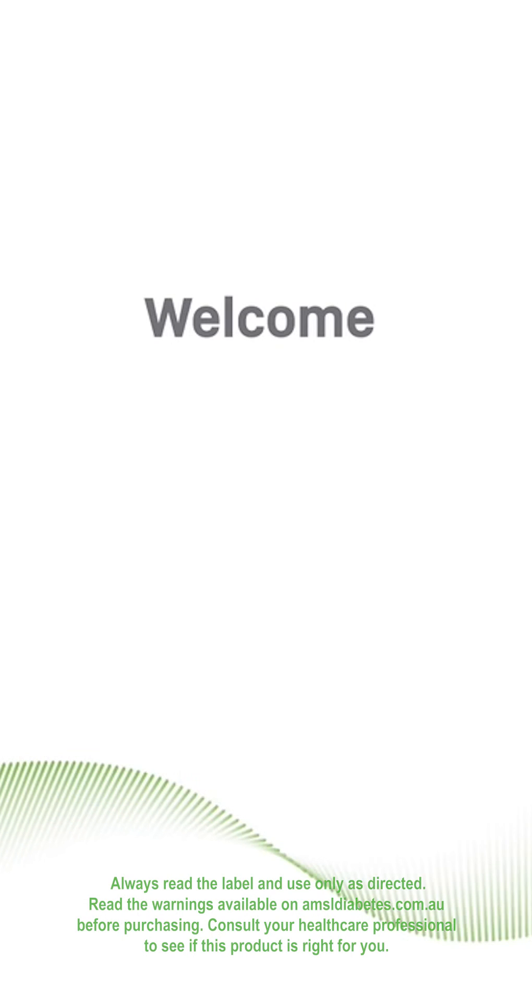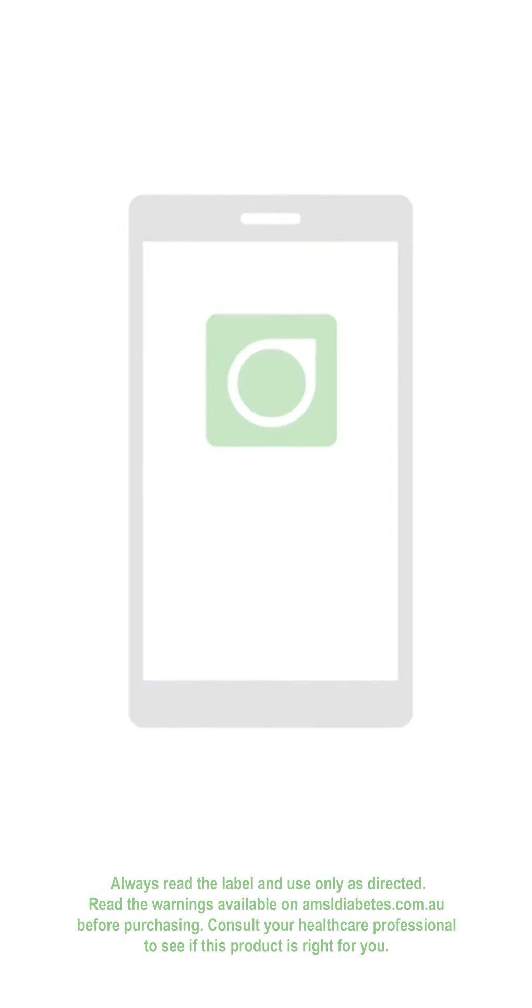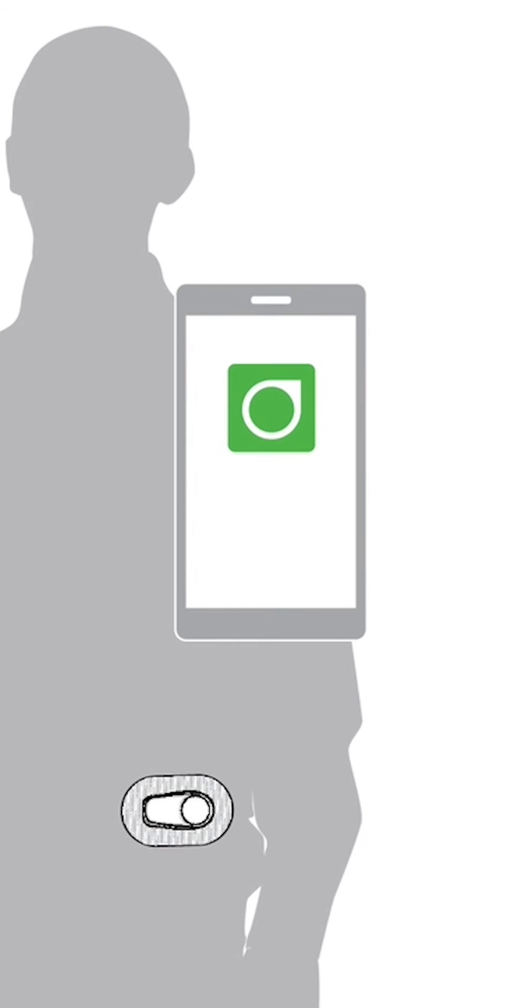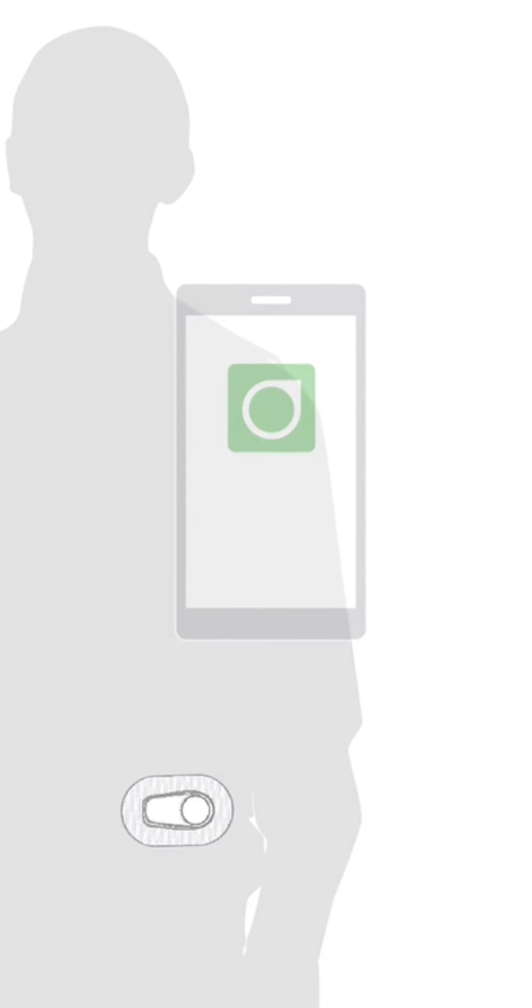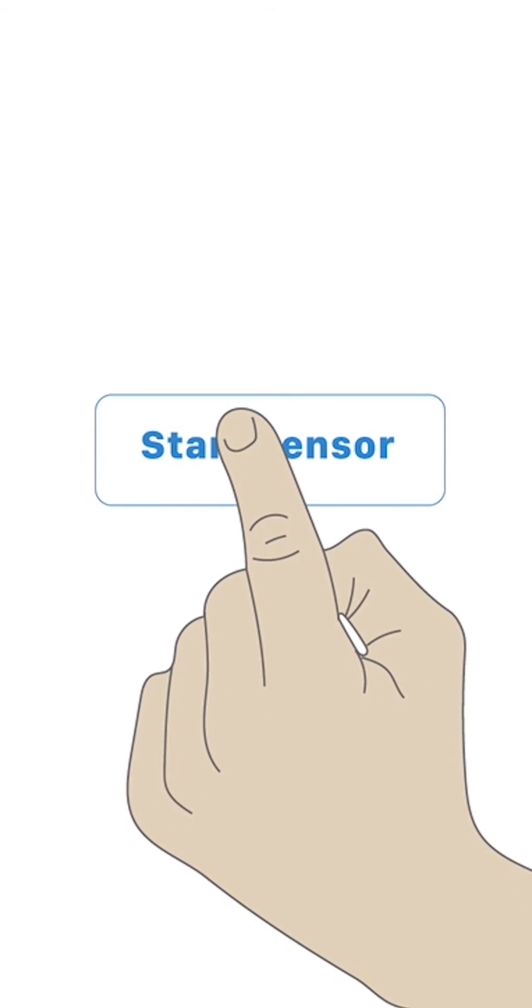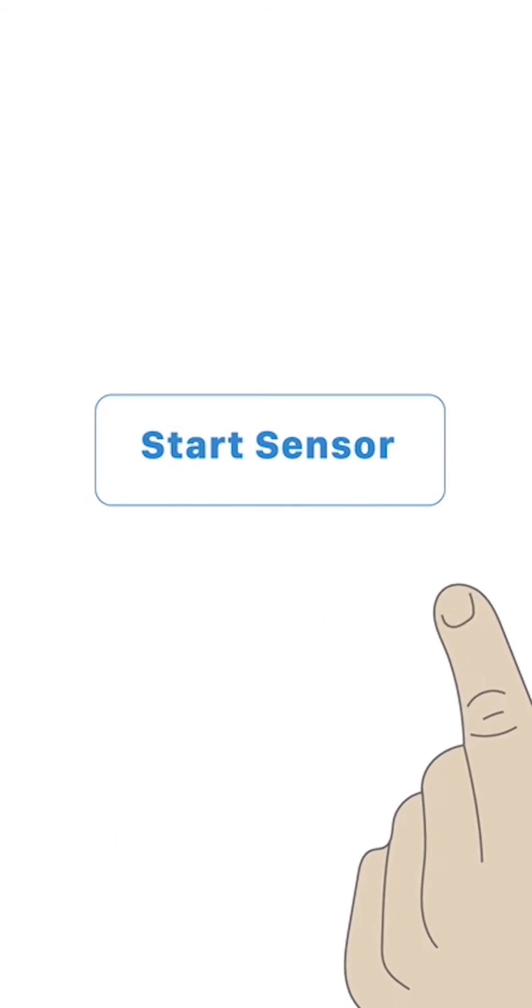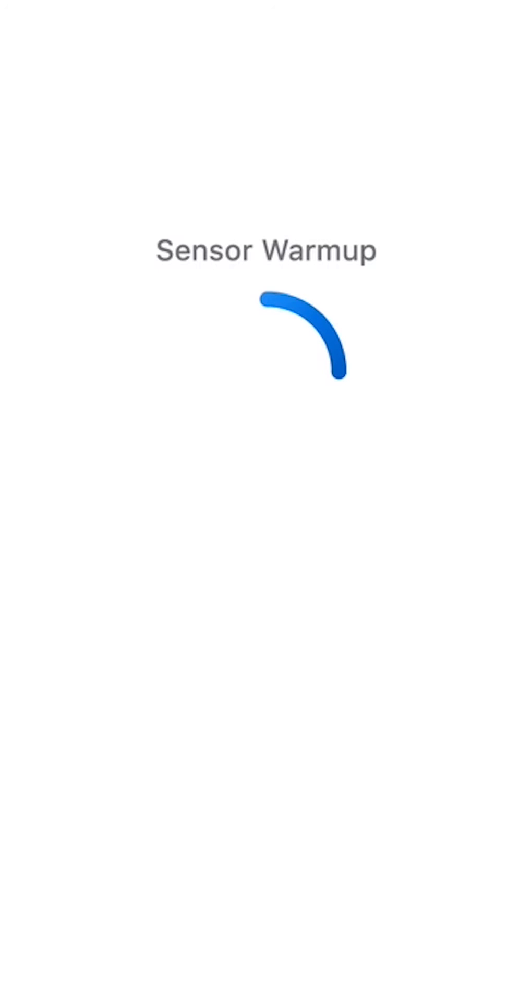Welcome to the Dexcom G6 Continuous Glucose Monitoring System or G6. Use your setup wizard to walk you through setting up your smart device, inserting your sensor and starting your sensor session. Your sensor session starts with sensor warm-up.